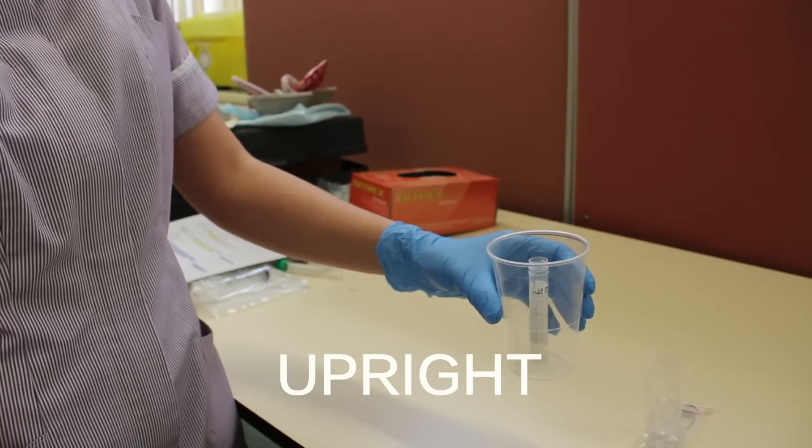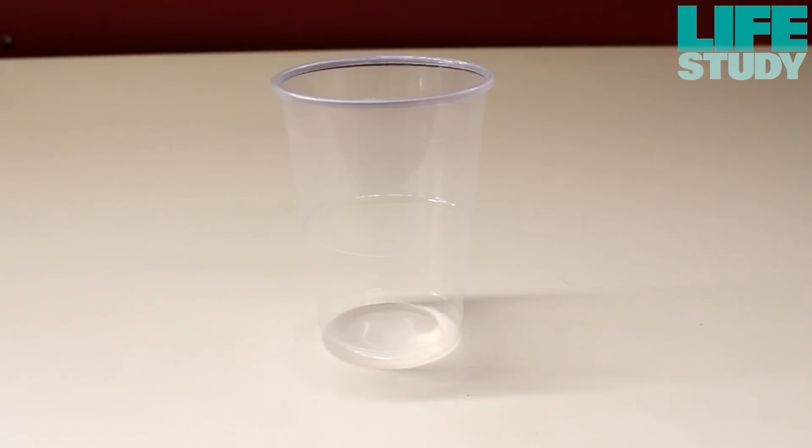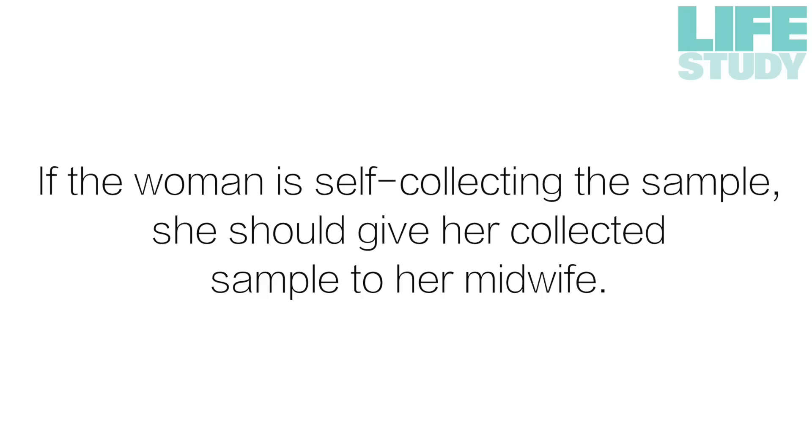Ensure that the sample stays in the upright position by placing the tube into the cup provided. If the woman is self-collecting the sample, she should give her collected sample to her midwife.